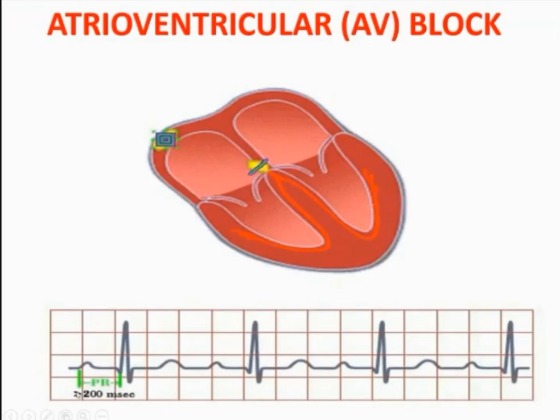إذا يعبر ال 200 ملي سكند هذا راح يبدي راح تعطينا فكرة أنه patient عنده diseased AV node, that there will be extra delay of the impulses in this important structure of the heart, after then it will give the electricity to the ventricle. يعني كل ما كان ال PR interval prolonged أكثر من 200 اعتبره هذا abnormal, okay? ممكن نقول عليه heart block اللي هو first degree, راح نحكي فيه شوية.